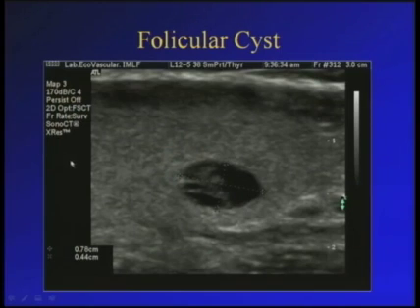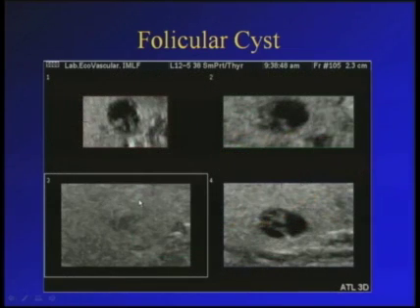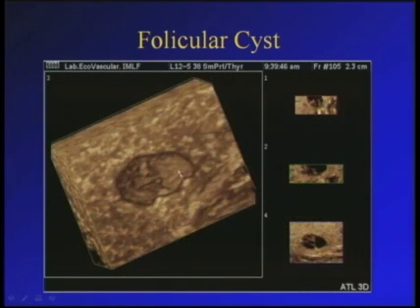A follicular cyst observed with 2D, power Doppler, and then the multiplanar 3D ultrasound, again with the three planes, and then a combination of volumetric and surface mode.